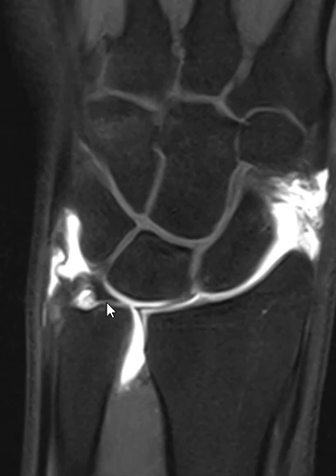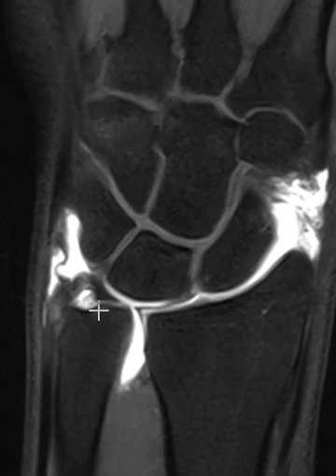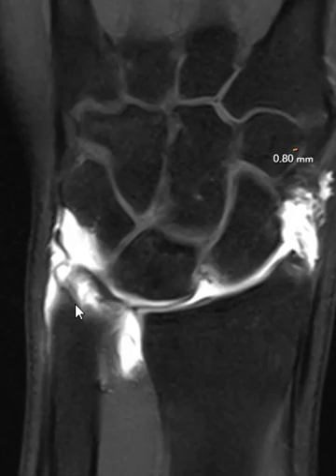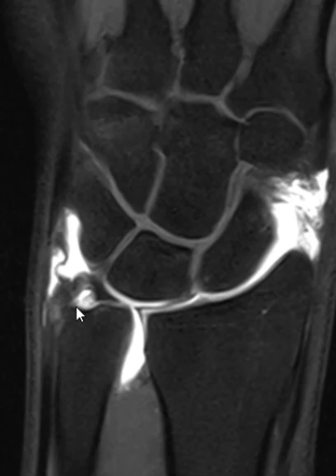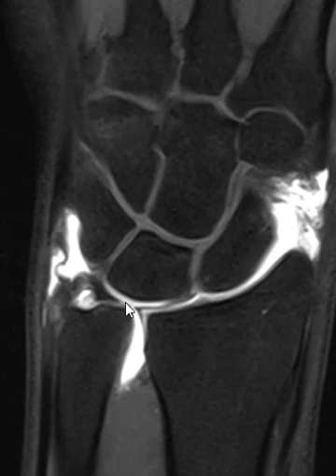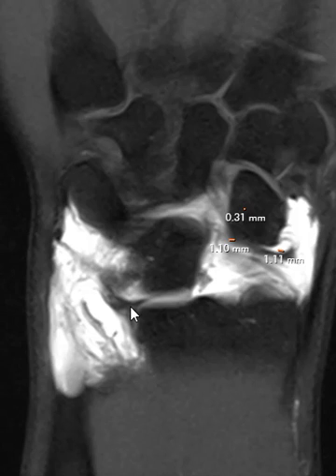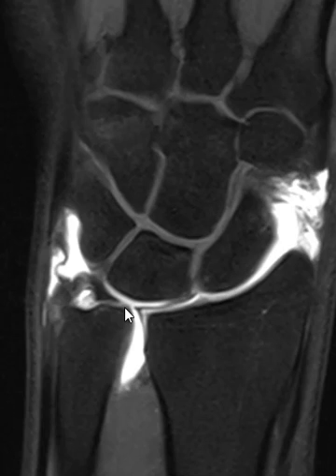Also, if we follow this across, we see two other attachments right over here. There's one in the little cupped area here that's called the foveal attachment, and the foveal attachment is torn. So I have two tears — one's right over here in the central disc going into that palmar band, and the other tear is over here at the foveal attachment.